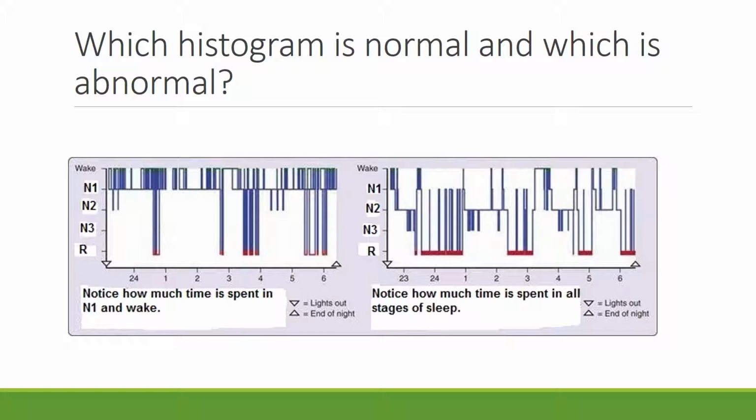So I would say the one on the right is a little bit more normal than the one on the left. But this person was probably sleep deprived or had some REM sleep deprivation, and that's probably why they had so much REM at the beginning of the night.